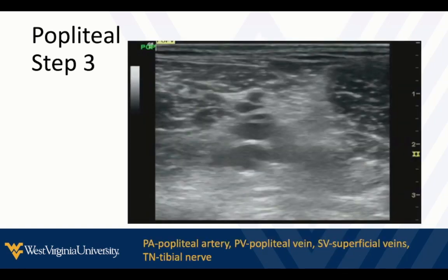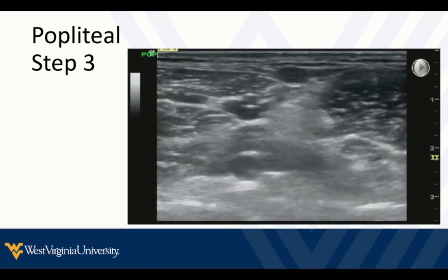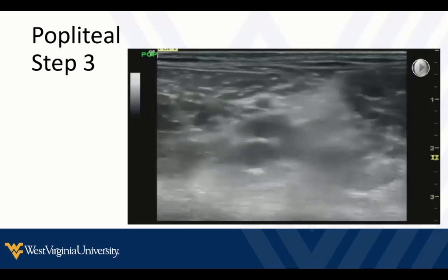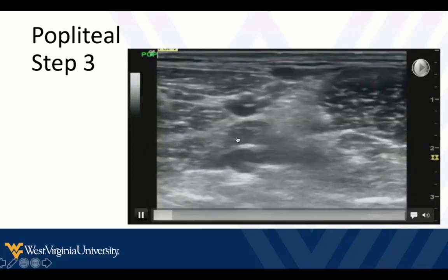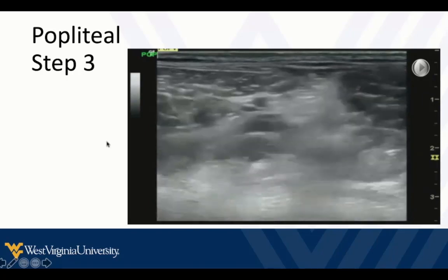Once we've seen those two junctions in the proximal thigh and followed the common femoral vein as distally as possible, we move to the popliteal fossa. Usually most deep and closest to the bone, we'll see the popliteal artery, and the popliteal vein is going to be sitting on top. We'll probably see some superficial branches — the most important thing is we don't get fooled by those. We make sure we find the big deep artery, and as we compress, we want to see bone edge into the screen. Seeing bone at the bottom of the screen is a good confirmation we're scanning deep enough. There is a little tiny arterial branch — just make sure you recognize that's not the popliteal artery. We really want all the venous structures visible to us to collapse.